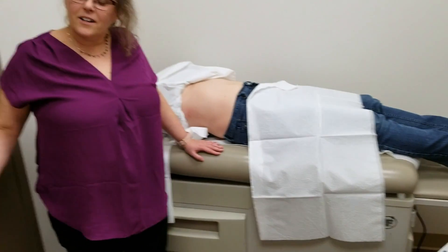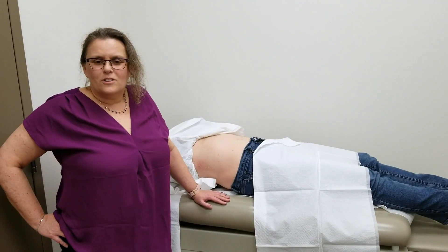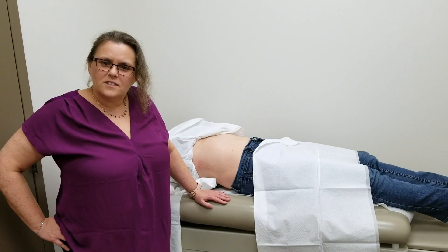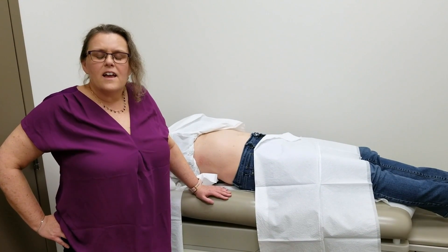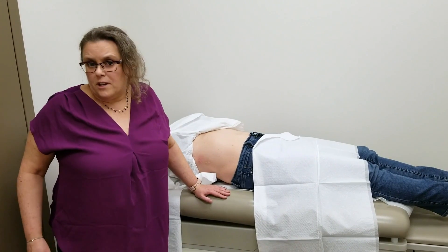I have a patient here who has graciously volunteered to be our model for this scan, and I'm going to proceed with doing the FibroScan as it would be done for a patient.